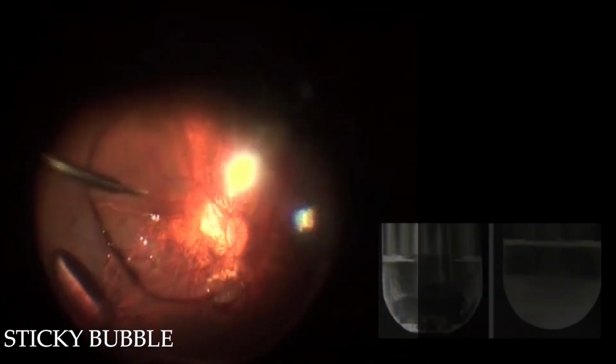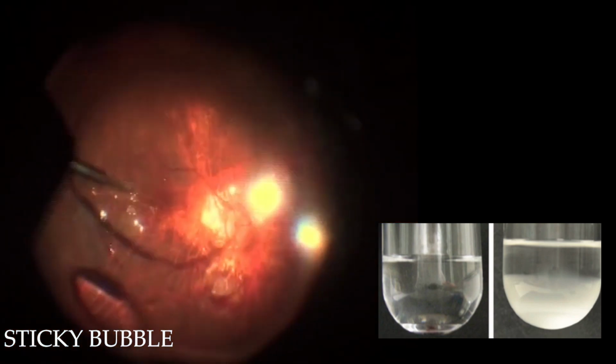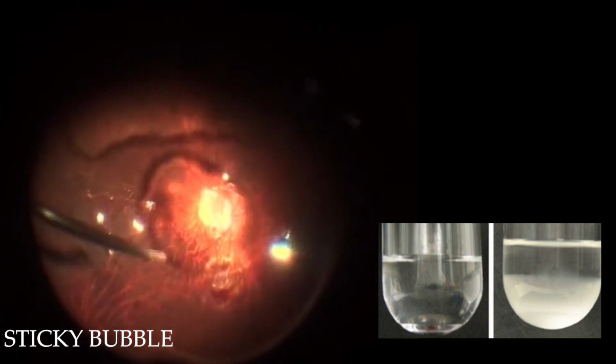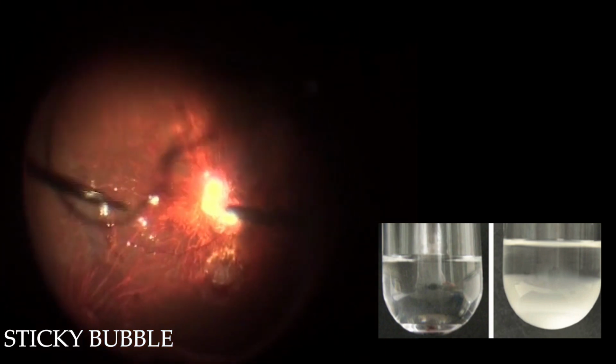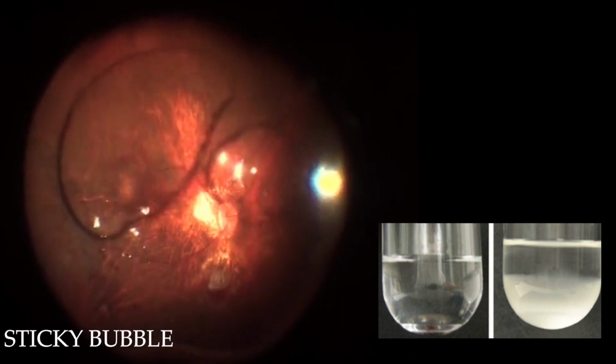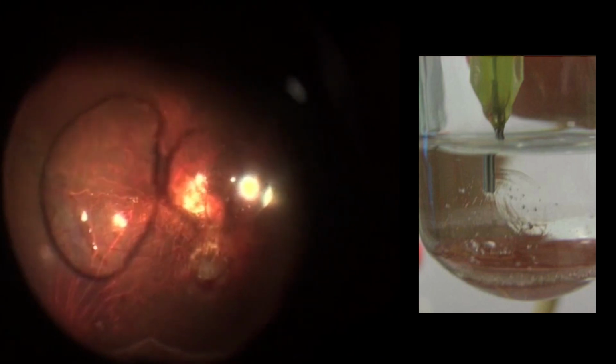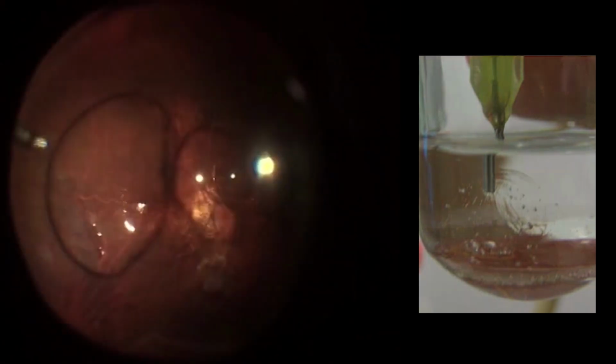Interaction of perfluorocarbon liquid with silicone oil resulted in dissolution of a small amount of oil into solution over time, and also ongoing inflammation and fibrin release intraoperatively led to the formation of a hyperviscous solution with increased shear viscosity and characteristic sticky bubble formation. This hyperviscous solution is difficult to remove even with aspiration at 600 mm mercury vacuum.